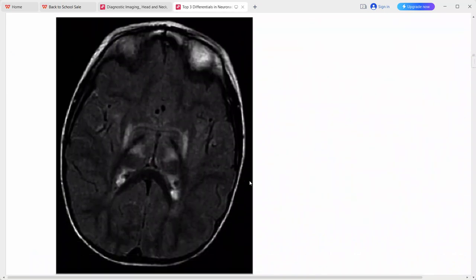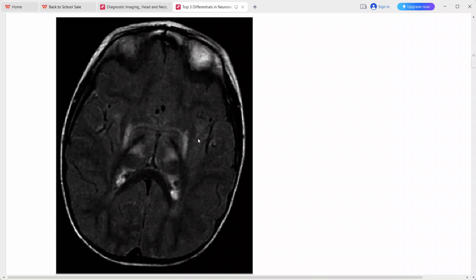This is an eight-year-old child with withheld history. FLAIR shows symmetric hyperintense signals in the posterior lateral putamen, ventral thalami, and bilateral insula. Increased signal in the basal ganglia and thalami in a child — the top differential is hypoxic ischemic insult, possibly secondary to near drowning. Wilson's disease, metabolic disorders like MELAS, osmotic demyelination, or NF1 can also be considered.